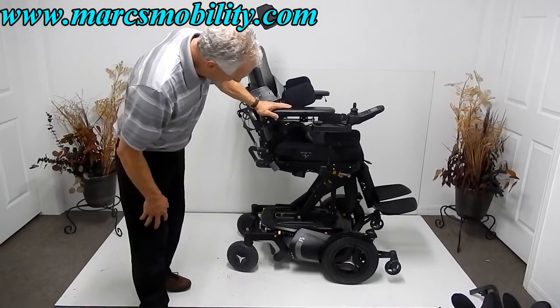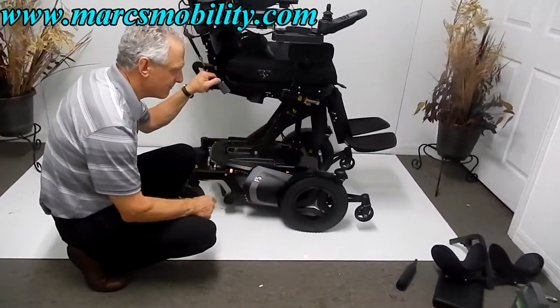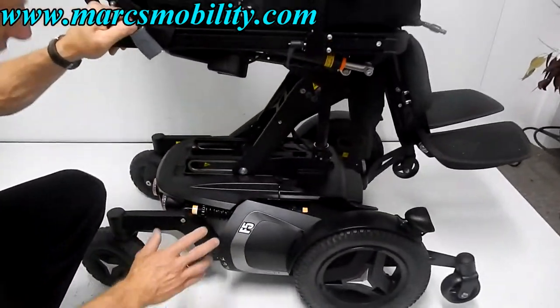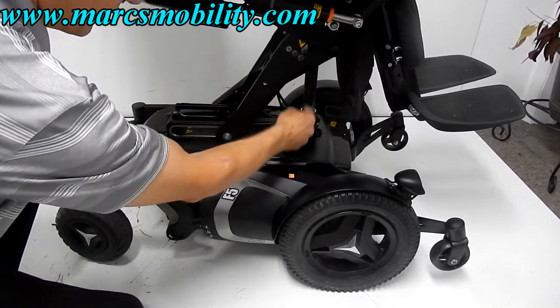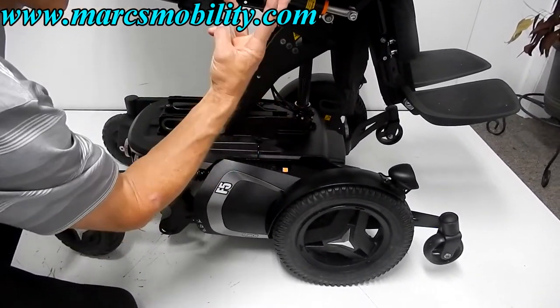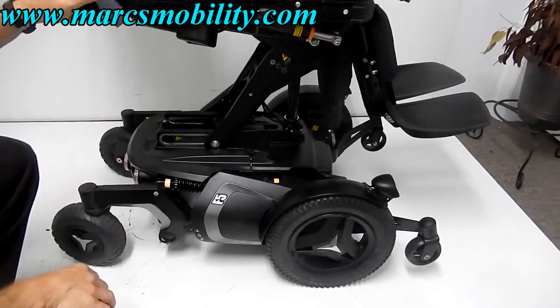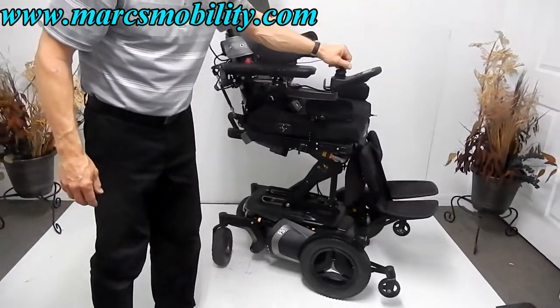This is a very nice seat lift. What makes it special is that it has three points of support — an armature on each side and a post — whereas most seat lifts only have a single post. This three-point design takes a lot of the wobble off the seat. Another advantage is that when the seat is elevated, you can still drive the chair.